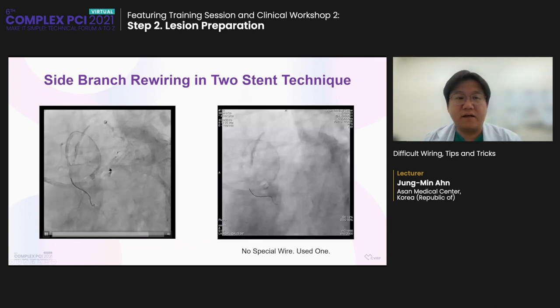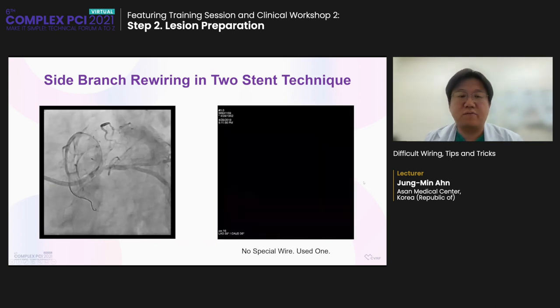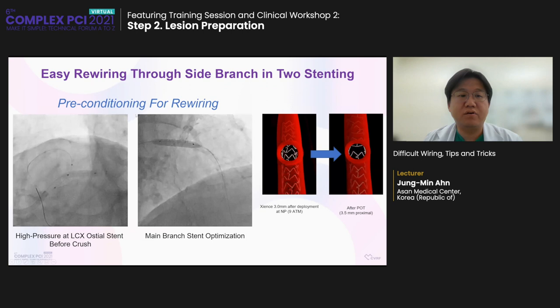This is the case of side branch rewiring in two stent technique. This is wire. Wire is very easily go through the circumflex. So for two stent technique side branch rewiring, I like to say that for make a preconditioning for easy rewiring. What is the precondition?